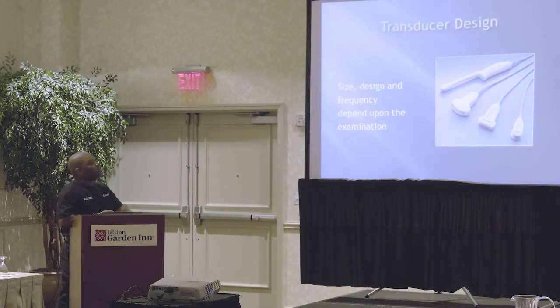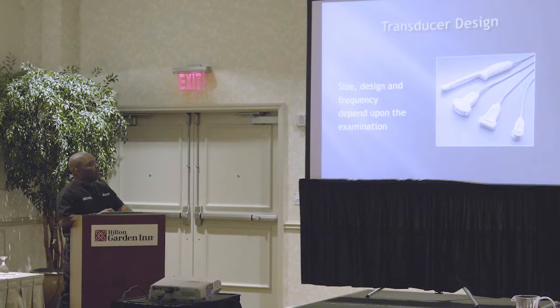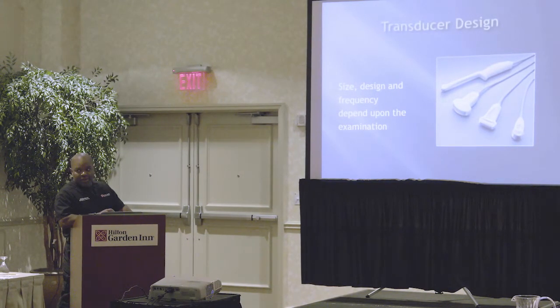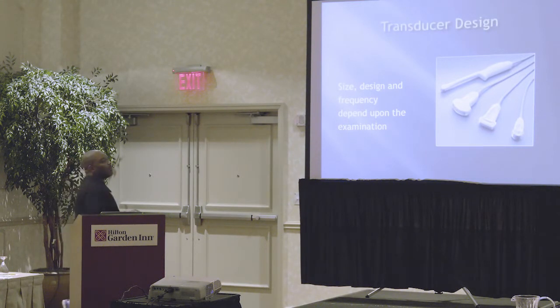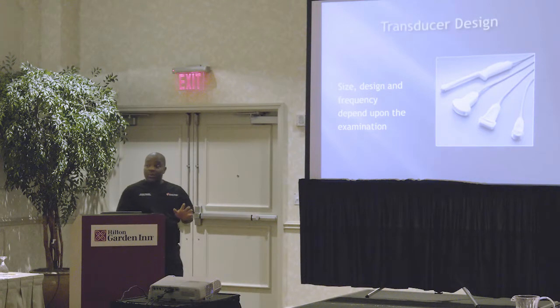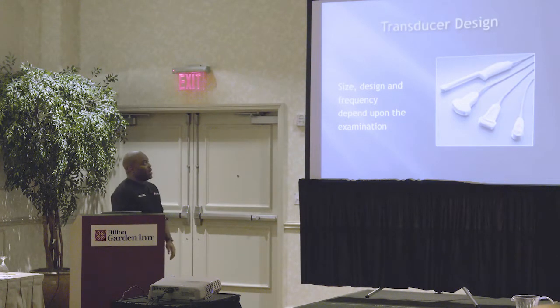And we'll talk about how you choose transducers in a minute. So most folks will say, oh, this is the one I use to look at organs. Not true, all right? You have to look at the number and know the frequency of the transducer. Most of the time, vascular transducers do look like this, but again, this could also be one that we use for solid organs. So don't memorize the shape of the transducer, memorize the frequency, and we'll talk about how you pick those, okay?